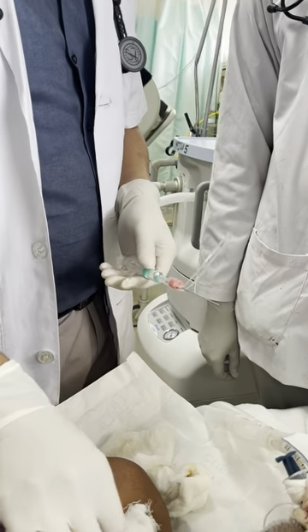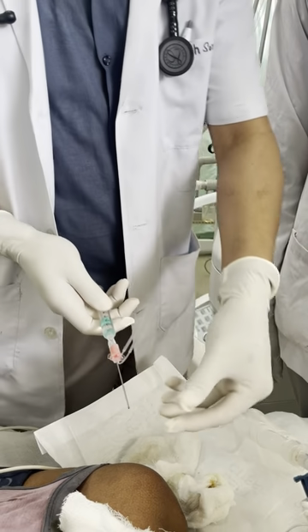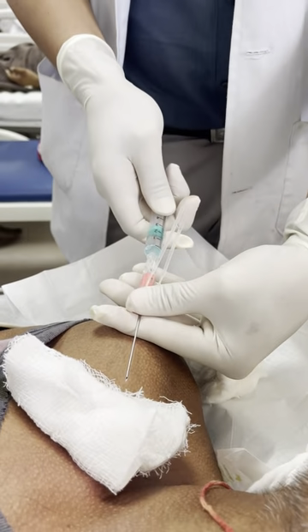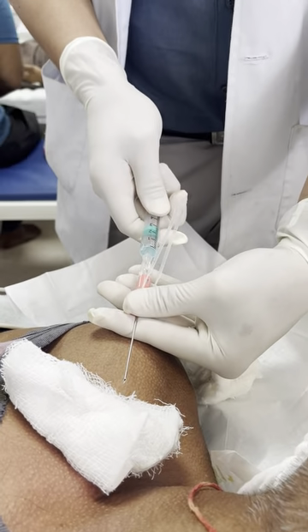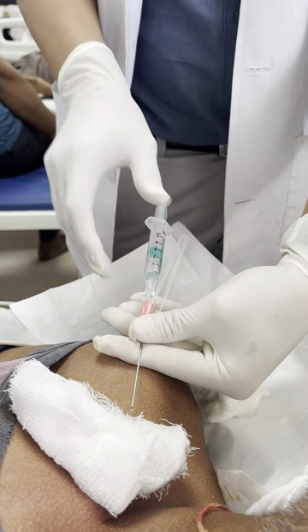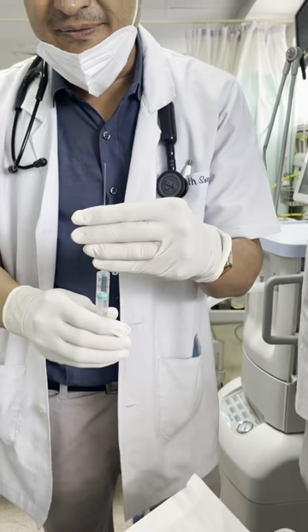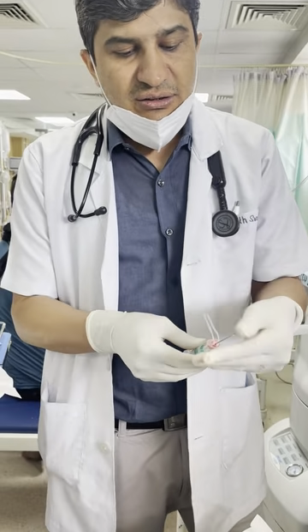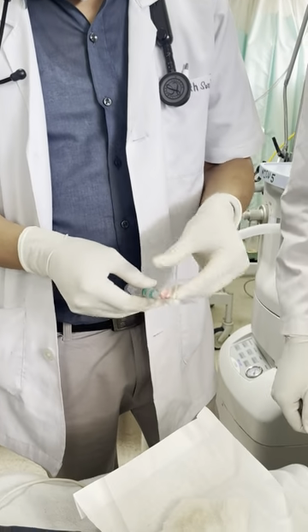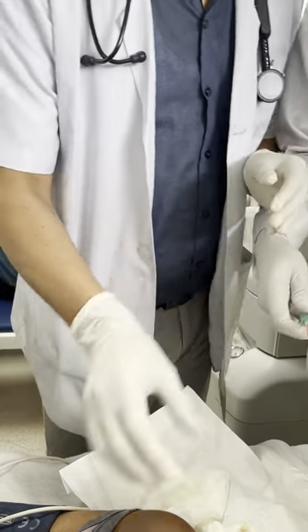So how will you confirm that it is vein? First, the color of the blood. You will hold the needle like this, and with this motion you will go inside. The moment blood comes, you will stop. Stand still, no further motion, not even a millimeter. This is how you do this. So hold it and start it. You hold the needle like this.